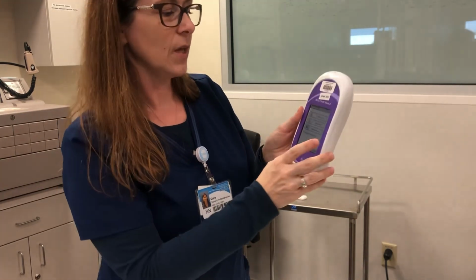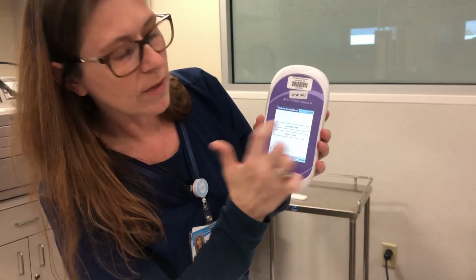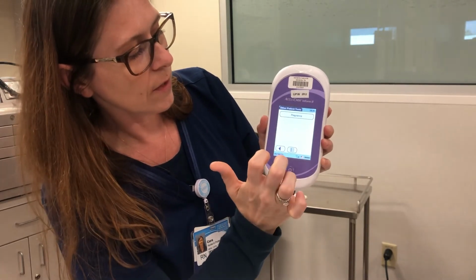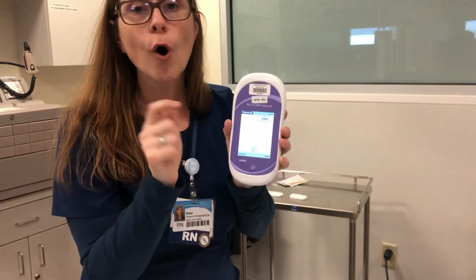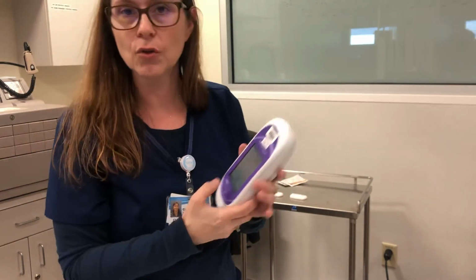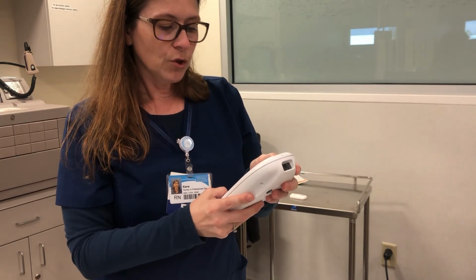All right, so you would enter patient results by going, instead of control result, you would go to patient result. And instead of running a glucose, you're going to put other test. When you hit other test, pregnancy, it's then going to let you scan the patient ID. Always scan their bracelet. Don't scan a sticker, scan their bracelet. And then you would then result through that way. And it will prompt you how to do that.